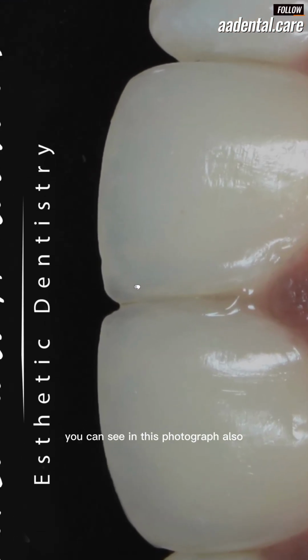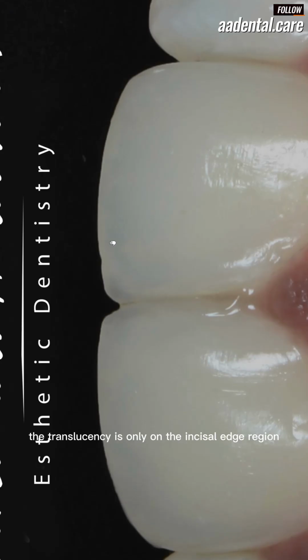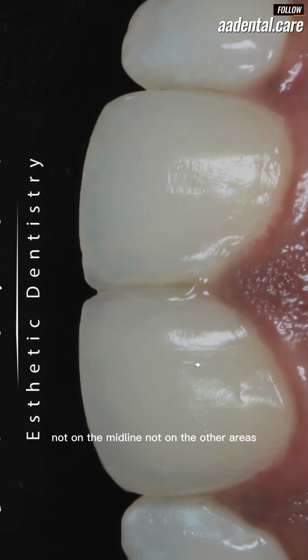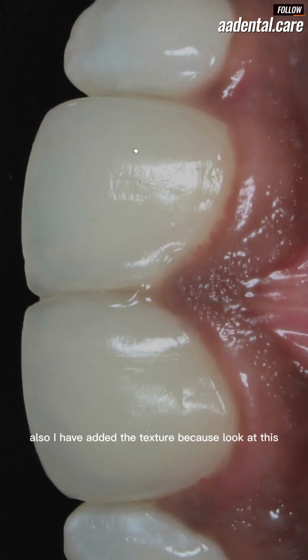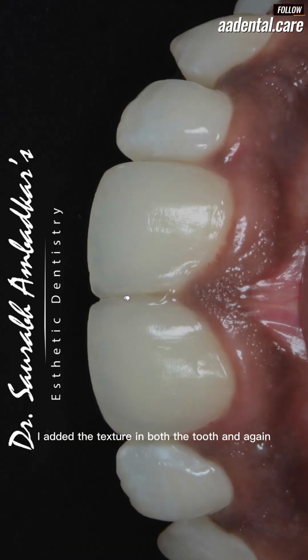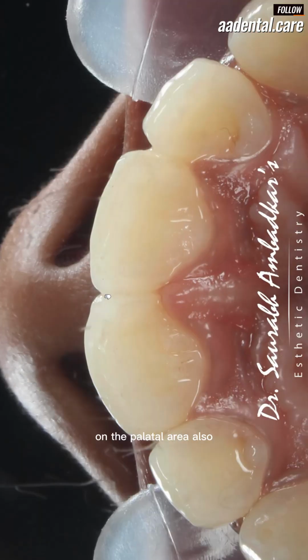Now in this case also, in this photograph you can see the translucency on the incisal edge region. In this tooth also the translucency is only on the incisal edge region, not on the midline, not on the other areas. The shade is also perfectly matched. You can see the texture also. I have added the texture because in the lateral there was a texture. I added the texture in both the teeth, and again a well finished, well polished restoration will last longer without any complication. On the palatal area also you can see the well placed midline without any staining even after 7 days.